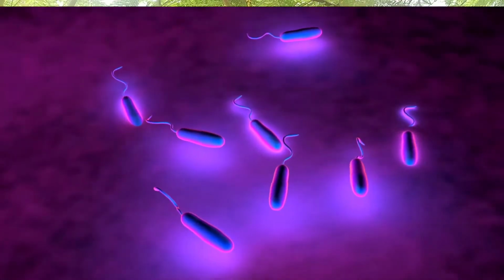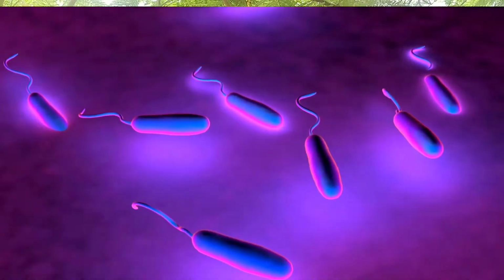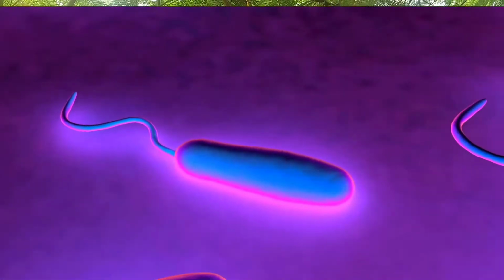Another thing that is seen in urine deposit is bacteria. Bacterial debris can be seen in urine deposits. When bacterial cells are seen in freshly voided urine, it is of significance. When it is in larger quantity, it is of significance. It simply means that this person has an infection. So it's also advisable to culture that urine to know the type of infection that person has.